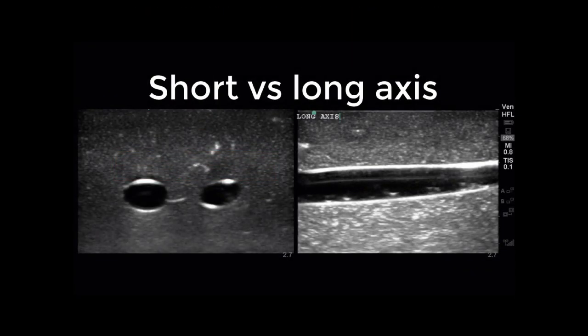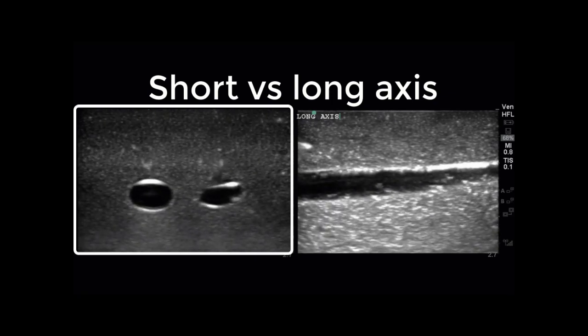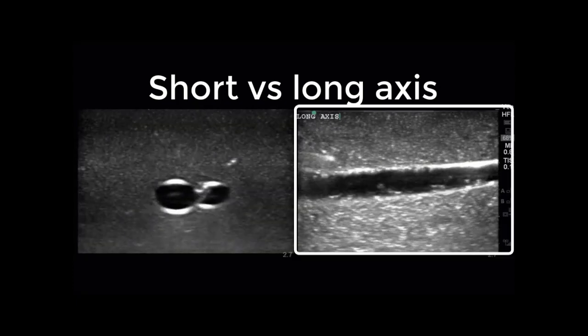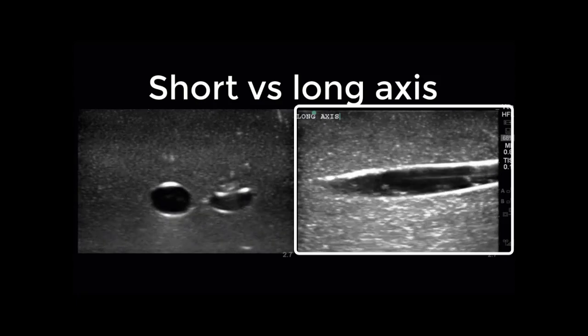These videos show a simultaneous recording of the short and long axis vessel cannulation in a gel mold. On image left, we can see the operator is continuously scanning in and out of plane to make sure he has the needle tip. On image right, we can see it is very easy to fall out of plane in our in-plane technique.